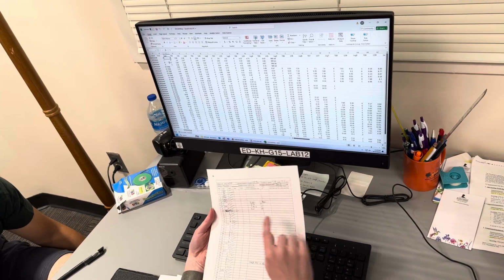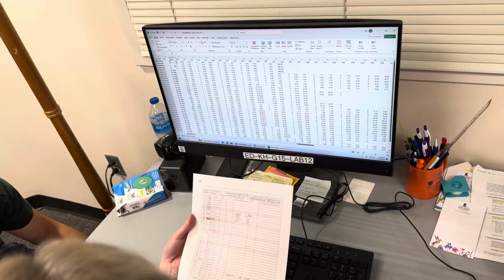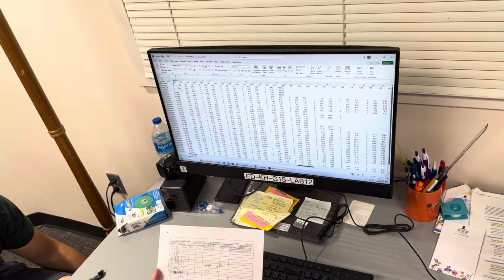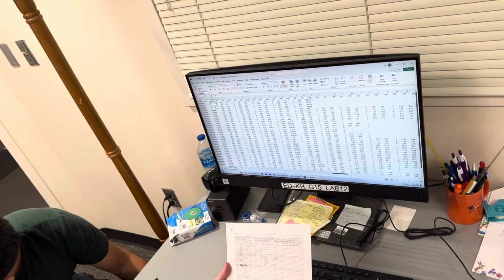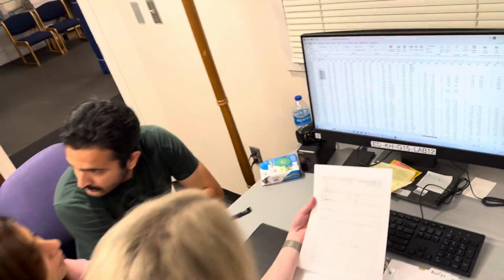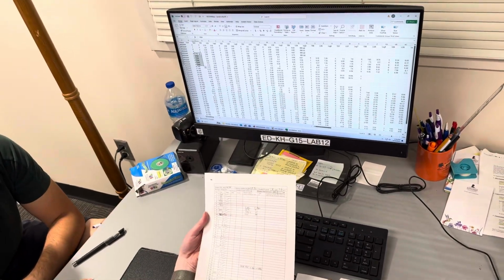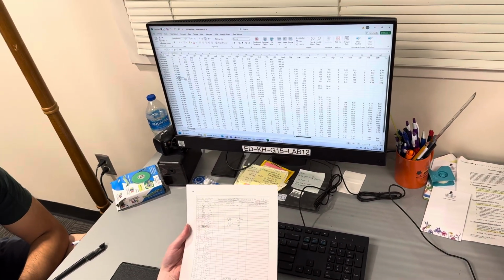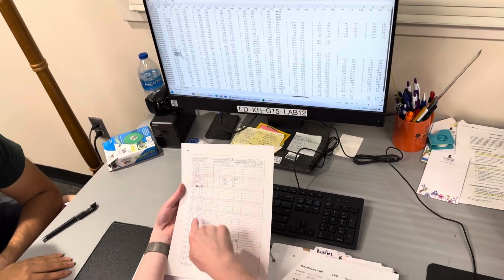And then from there, it went to the treadmill trials. And then we have little codes for that as well. And there's a paper on the wall over there that has the key to those codes if you forget. But basically, this is just regular treadmill walking, so there's no slipping or tripping. Treadmill slip. And then it went back to treadmill walking, and it all matches up on here.